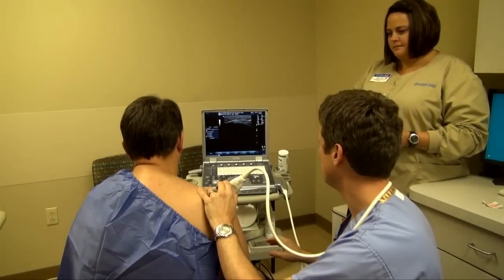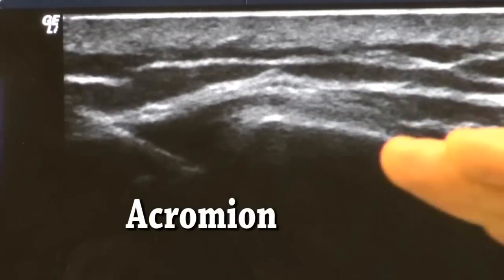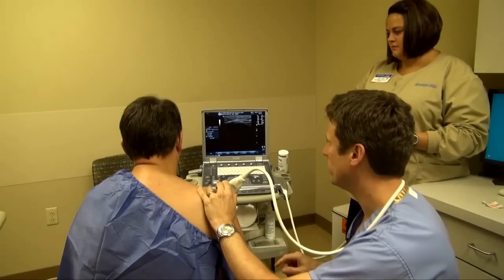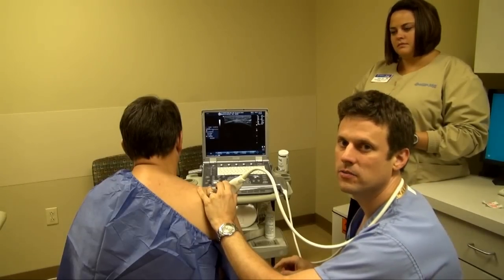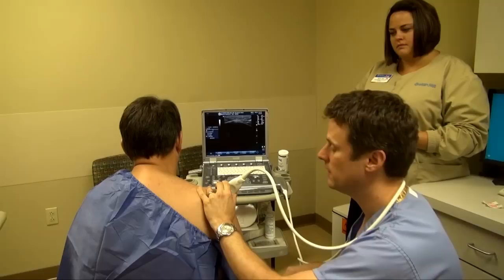So first I'm just going to find the acromion, which is this bone in the shoulder, and that is my landmark for positioning the needle. The rotator cuff, where he has his inflammation, is underneath that bone, and that's where we'll put the needle.